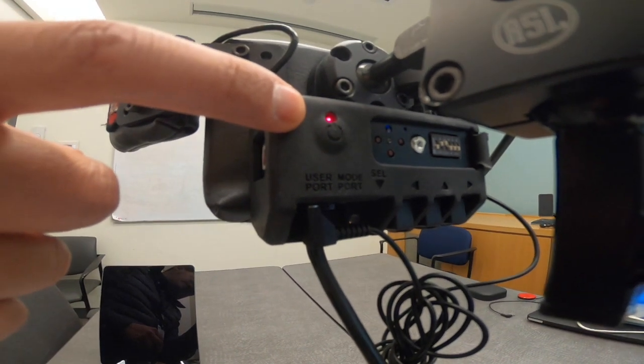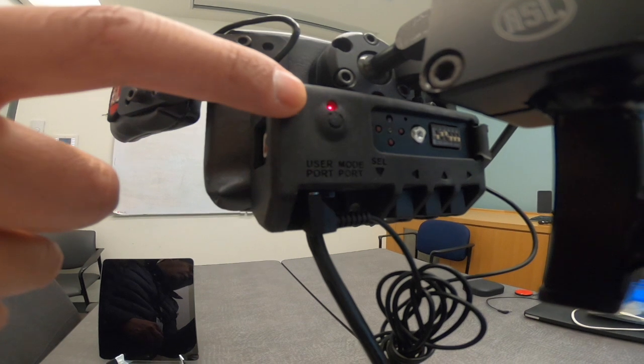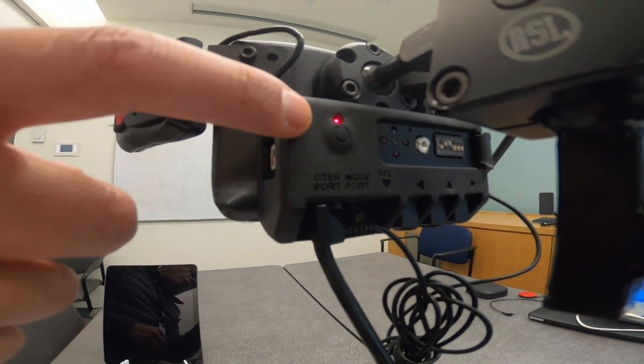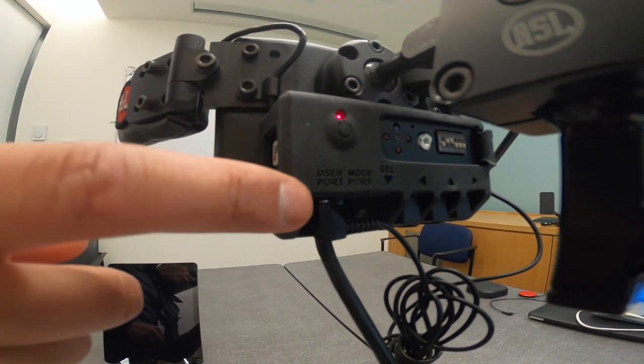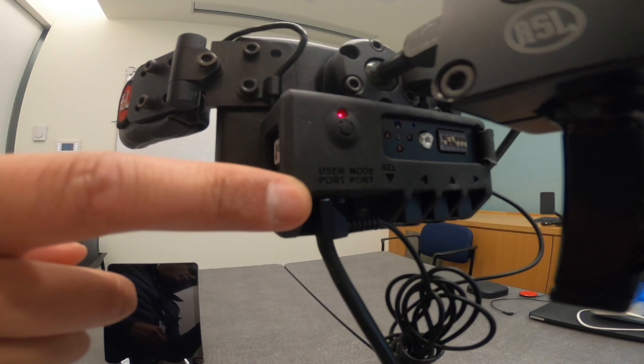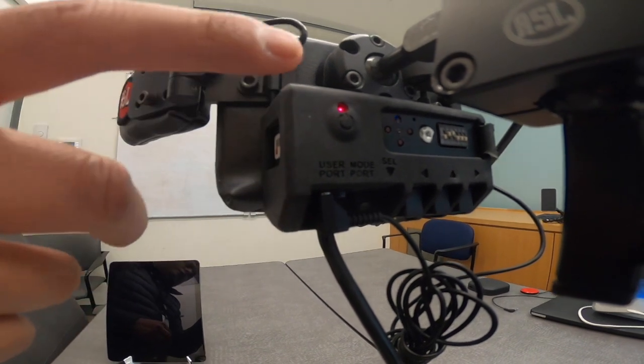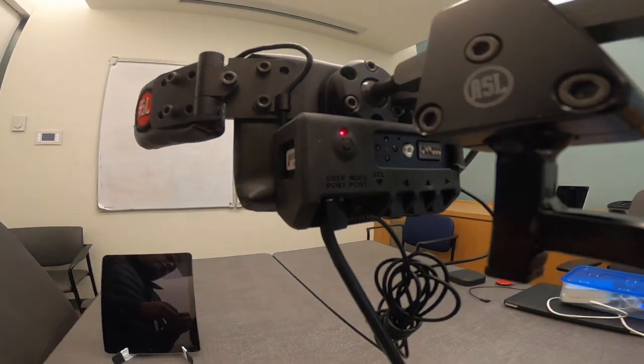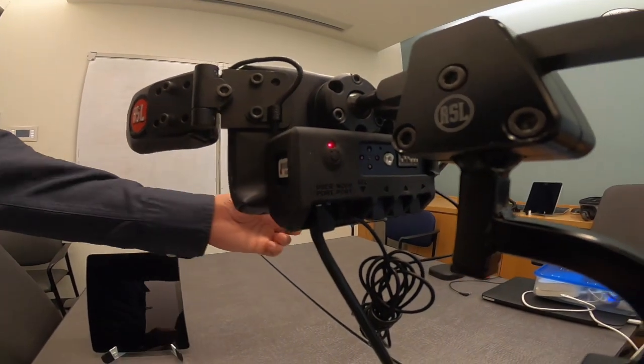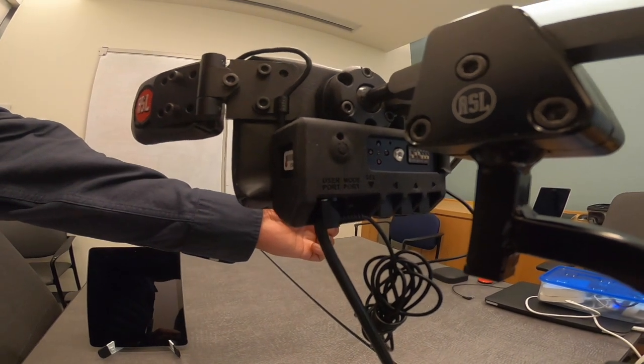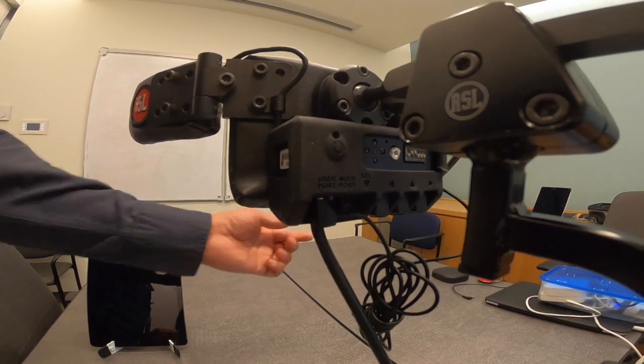At the moment, we only have the power on. That is why the light is a solid red. In order to put it in pairing mode, we need to press and hold the switch connected to the user port. Because it is not currently paired to anything, it will start to blink. Press and hold.